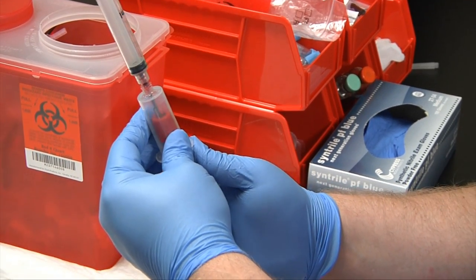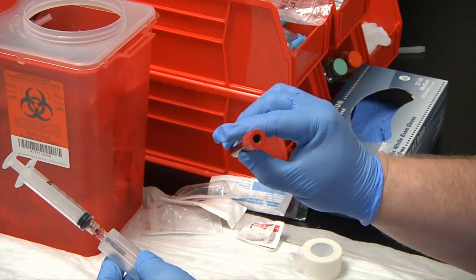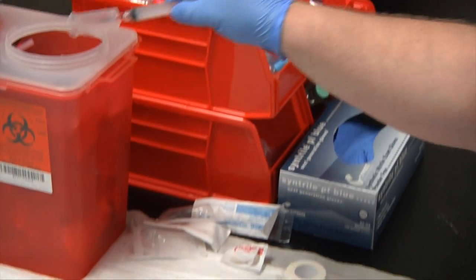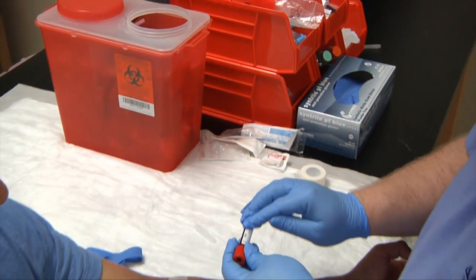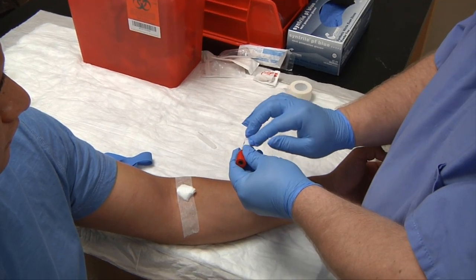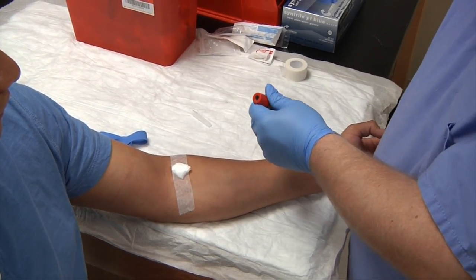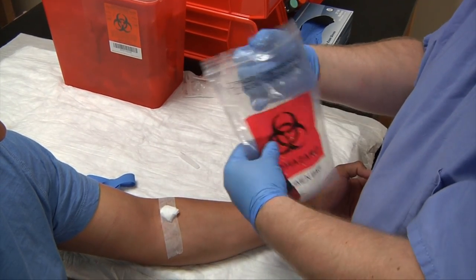Disengage the tube and invert three to four times. Discard the assembly into the biohazard box. Go ahead and put your patient's name, date, time, and initials on the label, then place the specimen into the biohazard bag and send it to the lab.